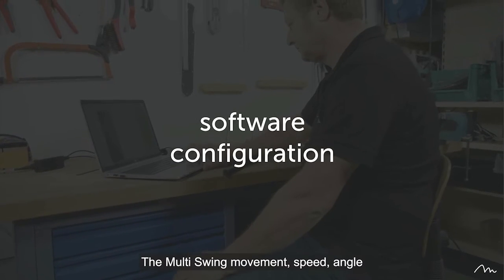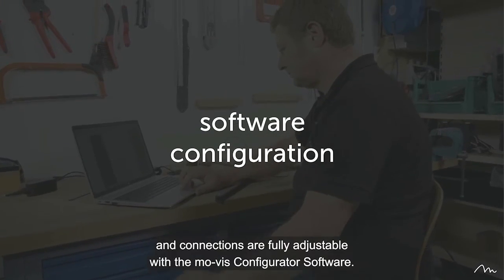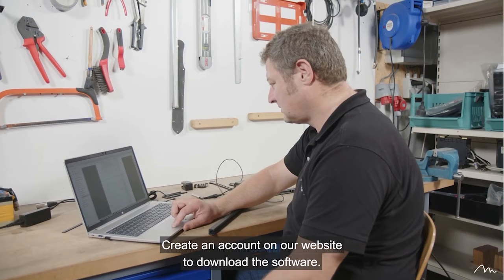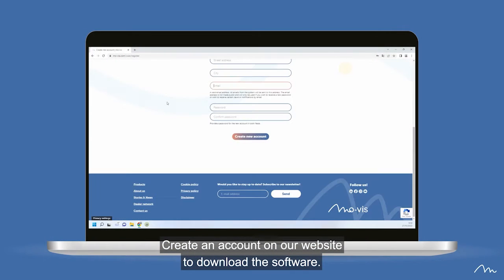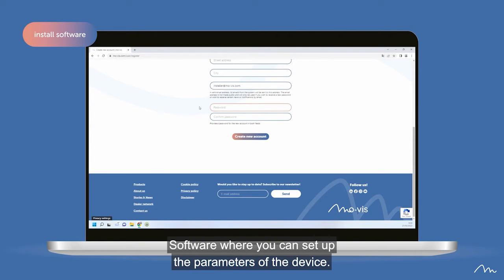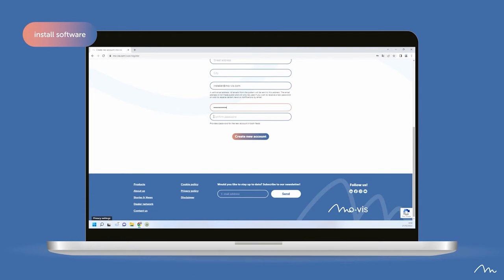The multi-swing movement, speed, angle and connections are fully adjustable with the mo-vis configurator software. Create an account on our website to download the software. You can choose your own password and use it to log in into the configurator software, where you can set up the parameters of the device.